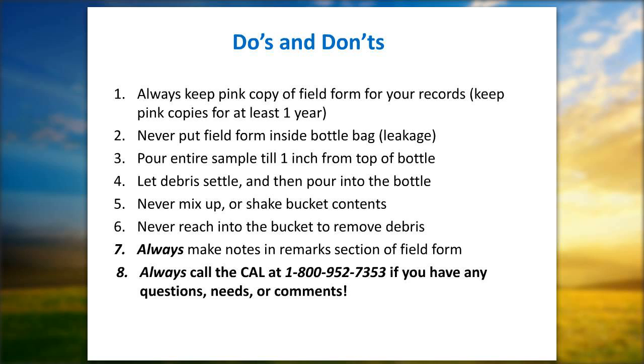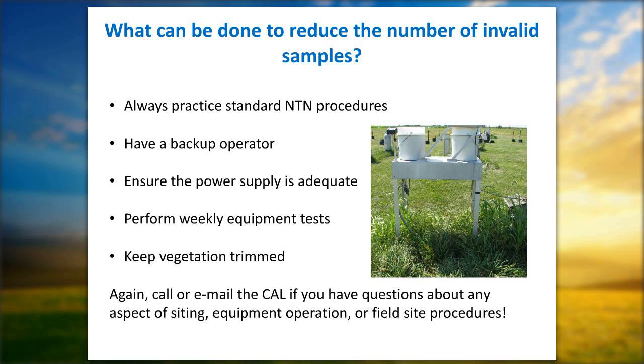Okay, if there's no comments or questions, next slide is what can be done to reduce the number of invalid samples. Always practice the NTN procedures. We have a protocol that we stand by. It was written, scripted, and practiced, and we've gotten the best results over the years from our protocol to avoid the invalidity of samples and keep the operator safe and sound.